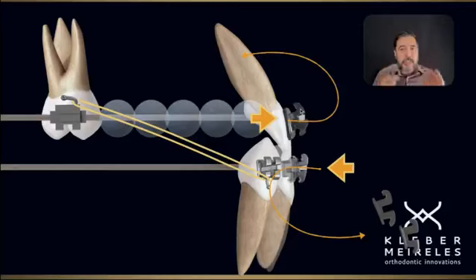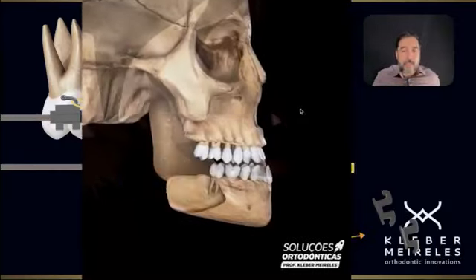So you must understand the concept of applying the torque by yourself so you can compensate individually. You compensate the inclination of upper and lower teeth in your own hand, in your bare hand. You're doing the torque for compensating because of that specific situation.